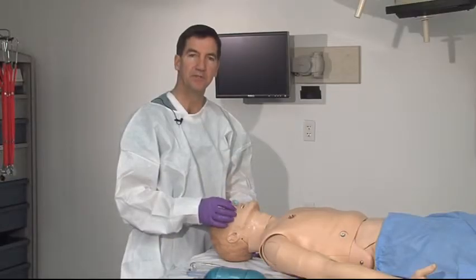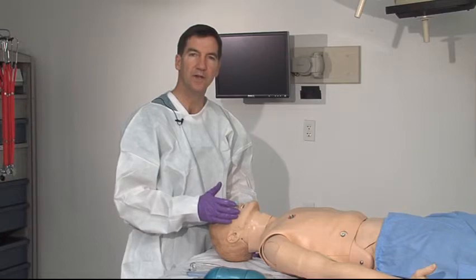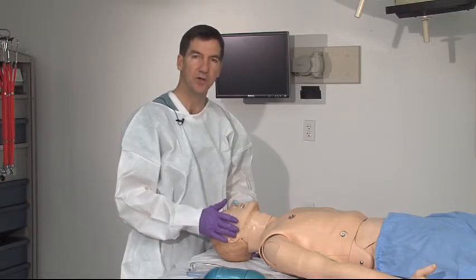This gives the patient a little bit of extra margin of safety in that if their level of consciousness is waxing and waning, the airway is maintained with this, yet it doesn't cause any gagging.